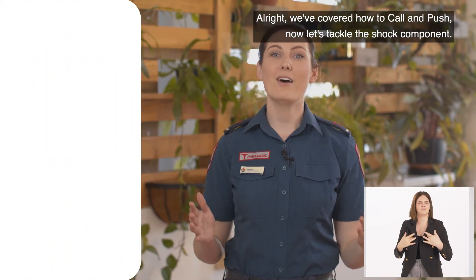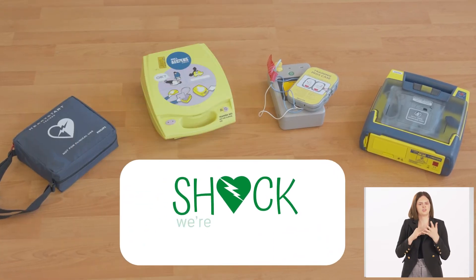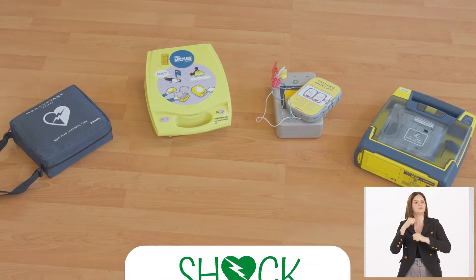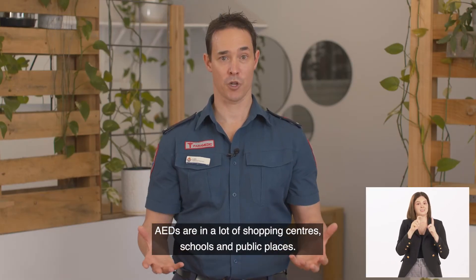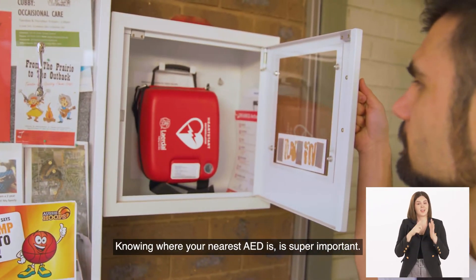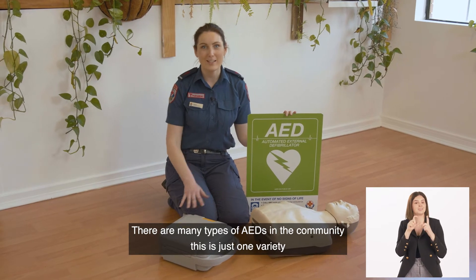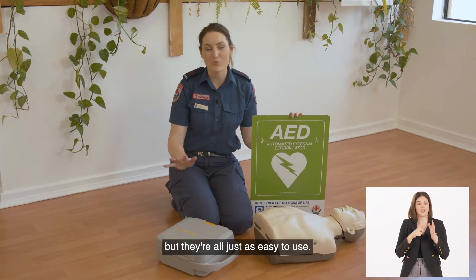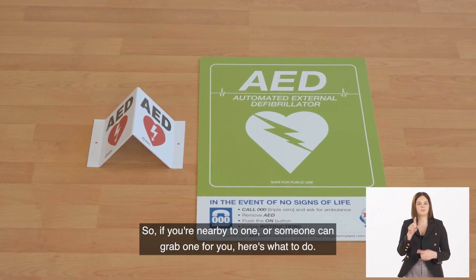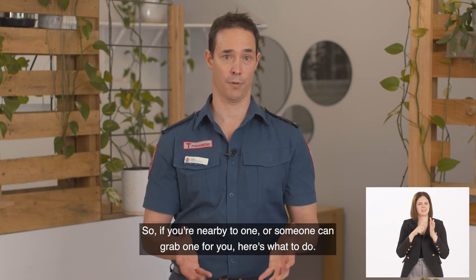Now let's tackle the shock component. When we say shock, we're talking about an AED, or a defib machine. AEDs are in a lot of shopping centres, schools and public places. Knowing where your nearest AED is is super important. There are many types of AEDs in the community — they're all just as easy to use. Just keep a look out for the AED sign. If you're nearby to one, or someone can grab one for you, here's what to do.